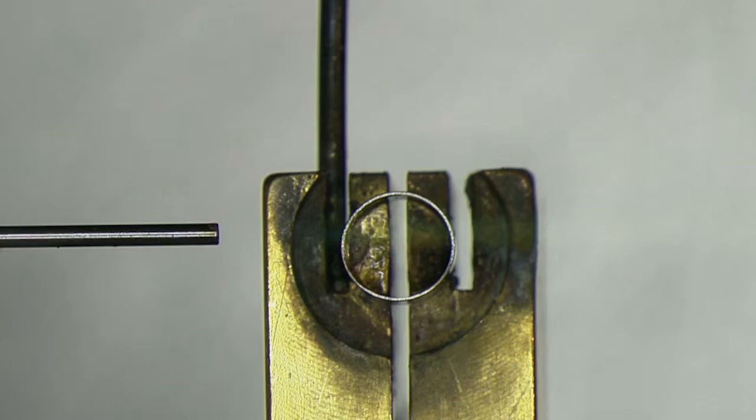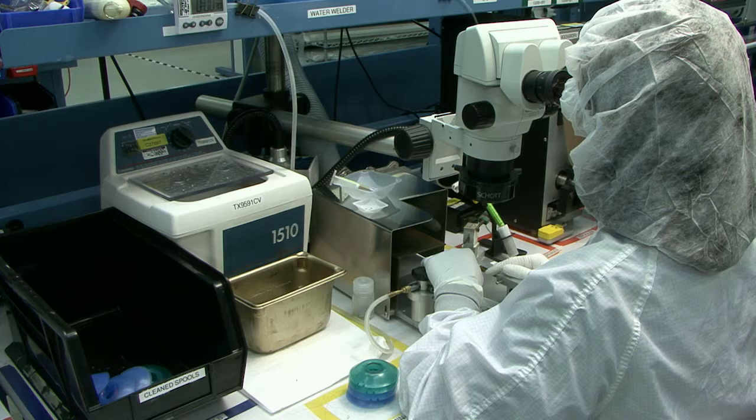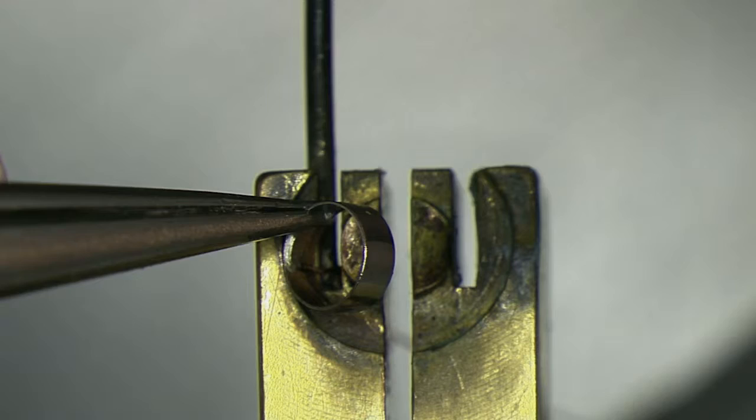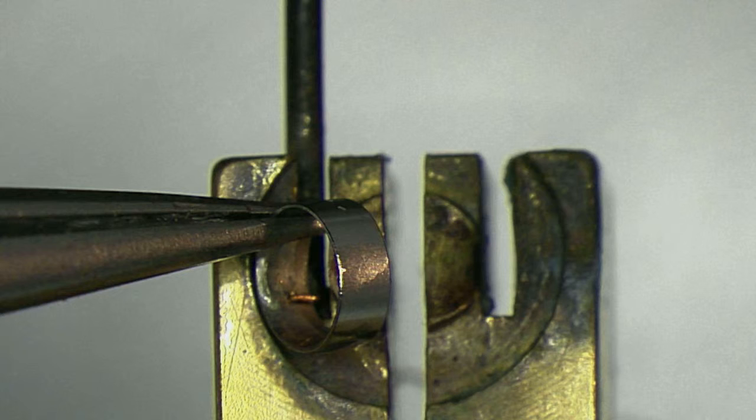Remember, you can reapply the torch to fully melt the paste. However, do not add more paste. We are aiming for just the right amount of heat to fully melt the paste and create a smooth, shiny joint. The paste will fill the area between the ring and wire.